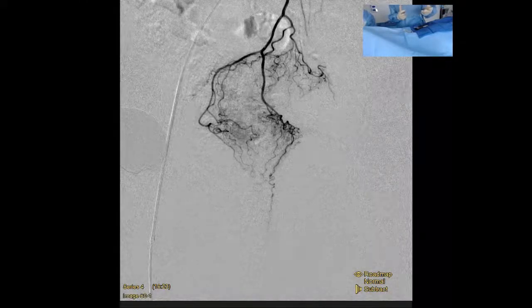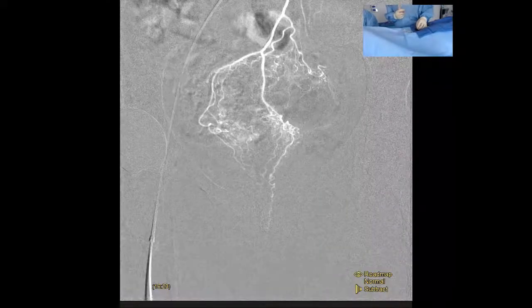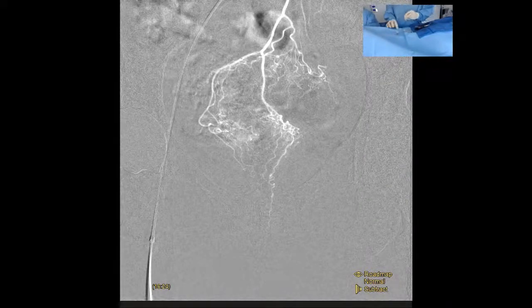Yeah, so we'll definitely want to target that artery, but as a female, she typically has these smaller size arteries that we identify, right? I just happened to take the right because it went to the right first. And then we're going to use the wire and go further distally down that right superior rectal artery.